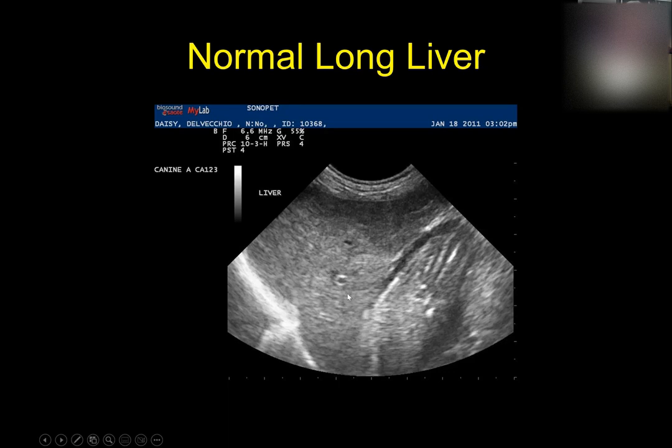Okay. So let me ask you another question. If I have this one slice of liver, and remember that slice is probably a millimeter or 2 millimeters in thickness, so it's one individual slice of the liver. It's like if you go to the deli at Foster's Food Fair, and they slice up some lunch meat for you, and you have this big chunk of roast beef, and they slice it for you.